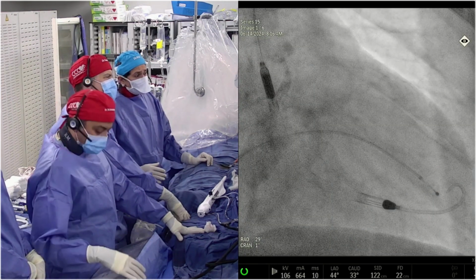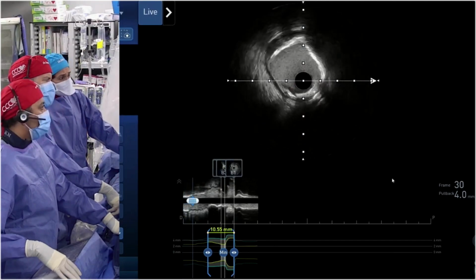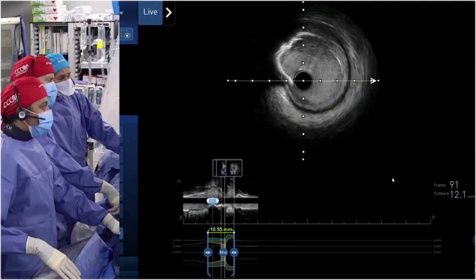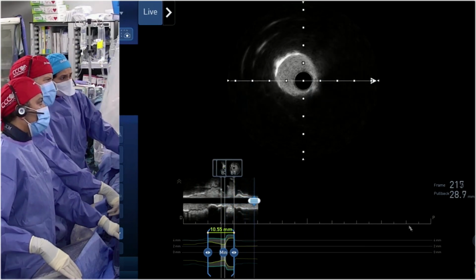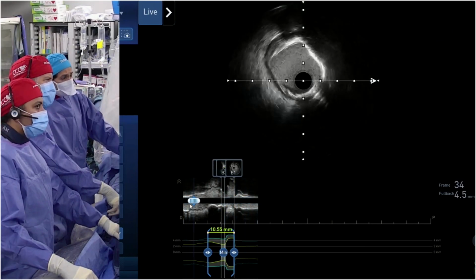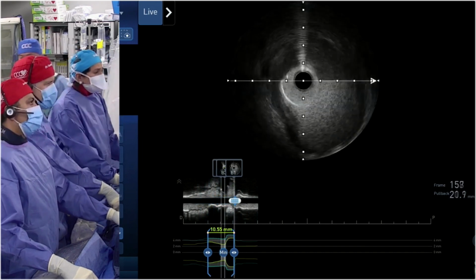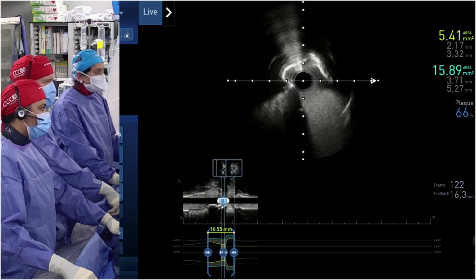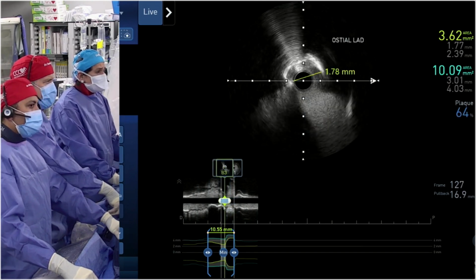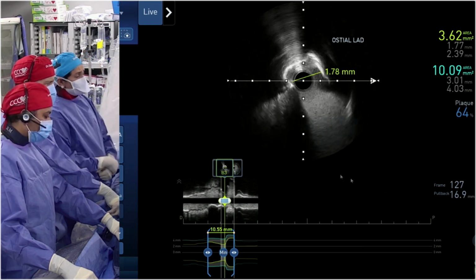So what we did was a balloon valvuloplasty, showing the right coronary artery. This was just a 20 millimeter balloon, which we did. And then we placed an impeller. The question always comes up. Agree with what John Lasala was saying, that it's a simple lesion that we could do with this kind of an EF. We could quickly do rotational atherectomy, go ahead and do either a single stent or double stent strategy of the left main and circumflex.